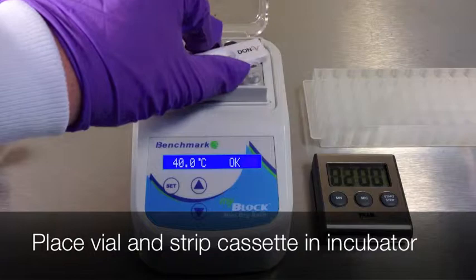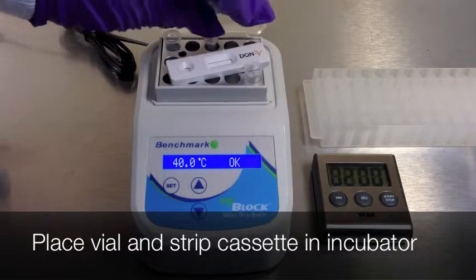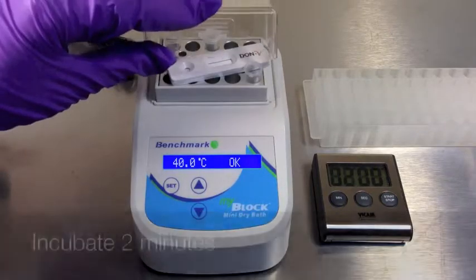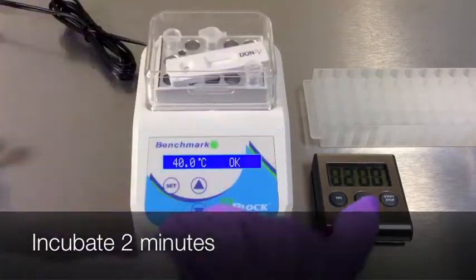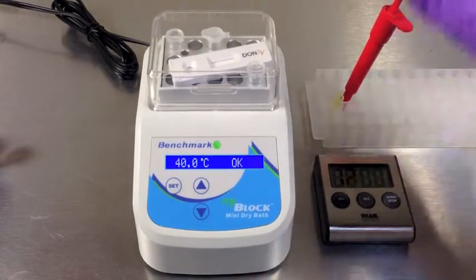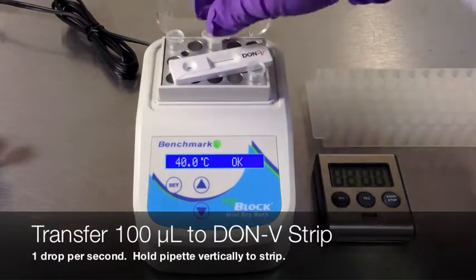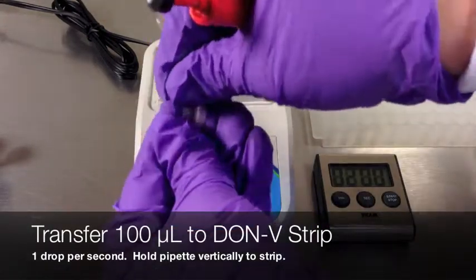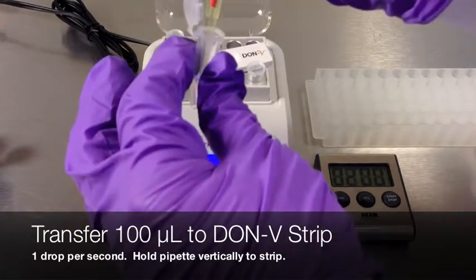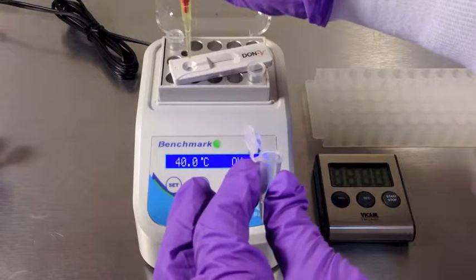Place the vial and a Don V strip cassette into the incubator. Cover the lid and incubate for 2 minutes. Transfer 100 microliters of the mixture to the Don V strip, dropping vertically into the circular opening. Then cover the incubator lid and develop for 5 minutes.